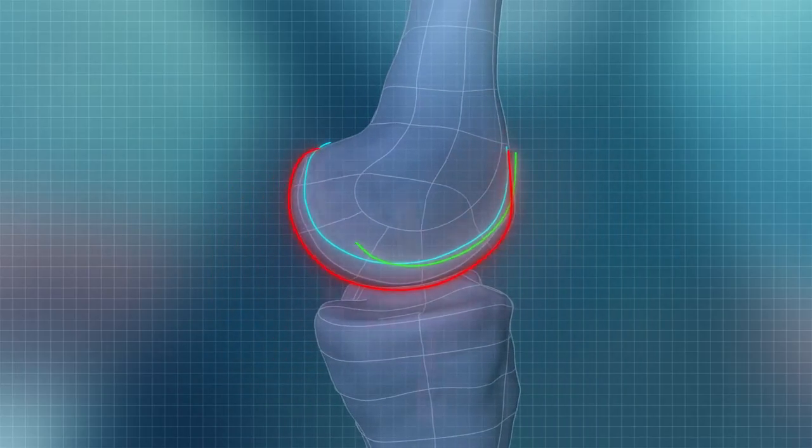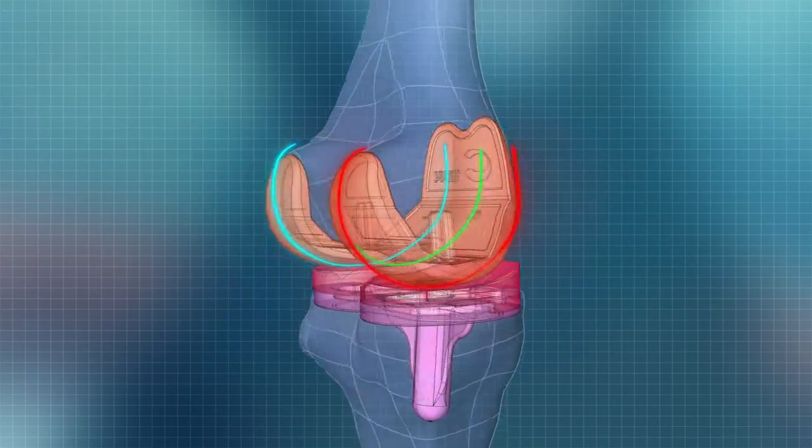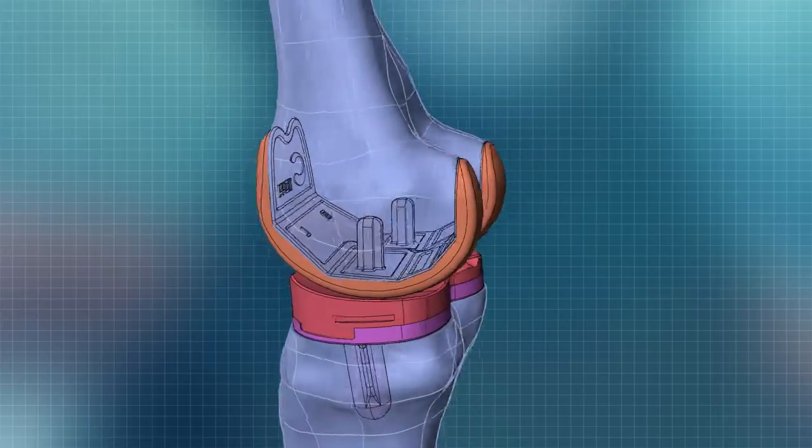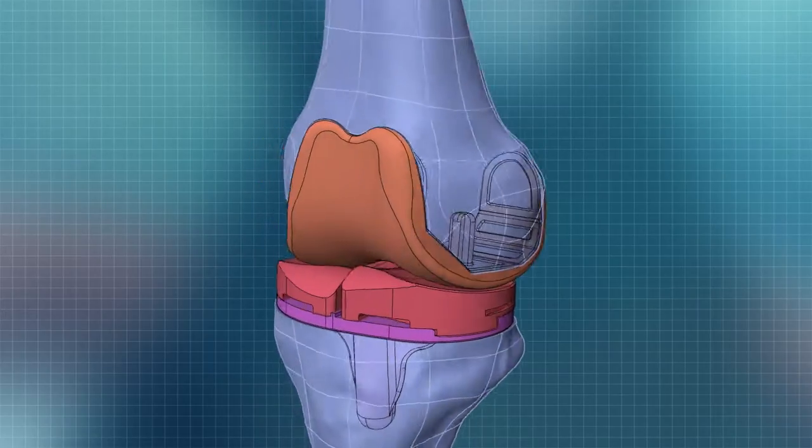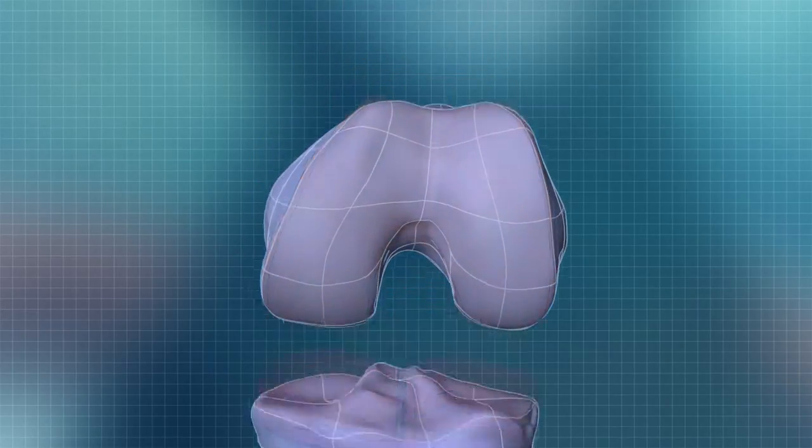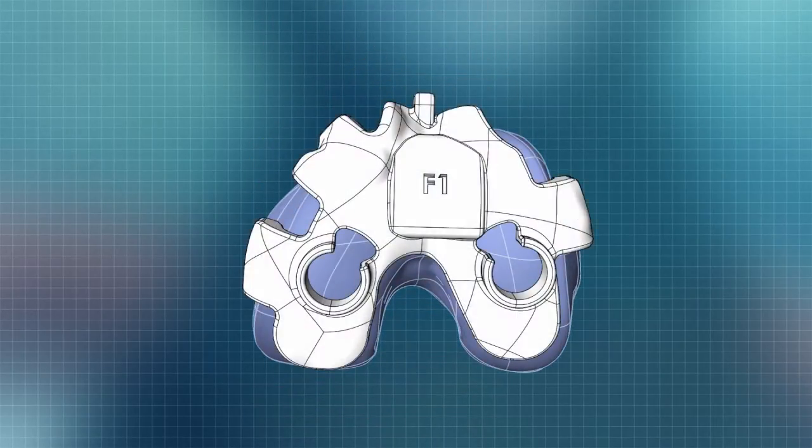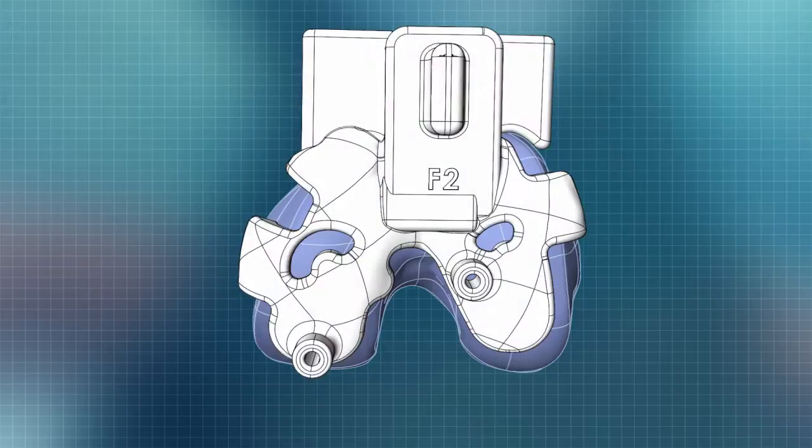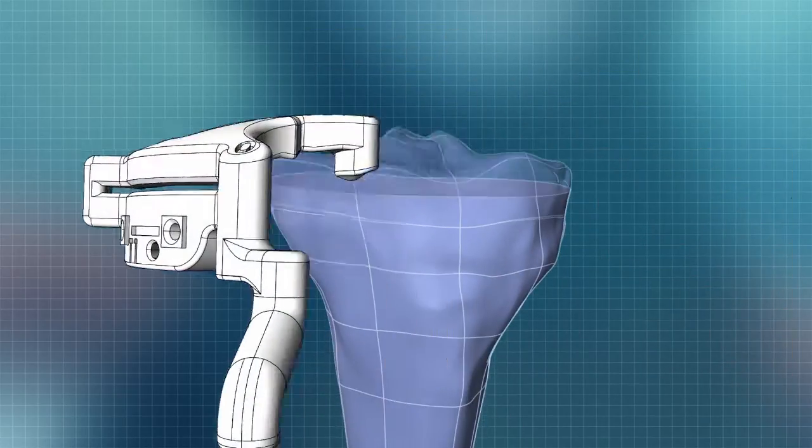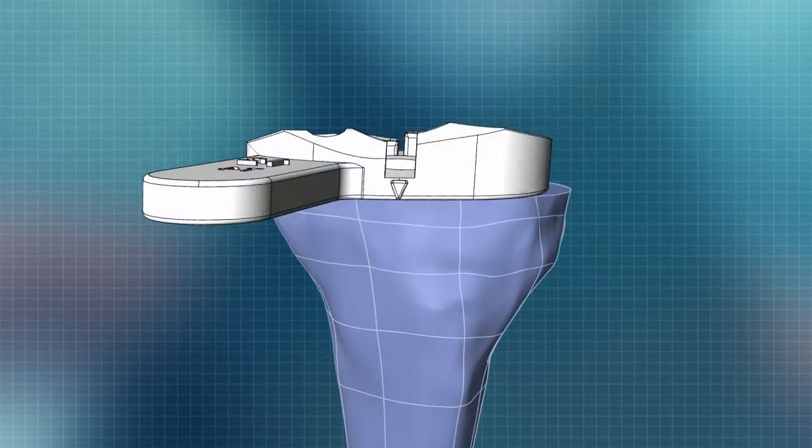These are designed to address common causes of patient dissatisfaction, including pain and unnatural feel. That same 3D model is also used to design patient-specific instrumentation for each step of the surgery.